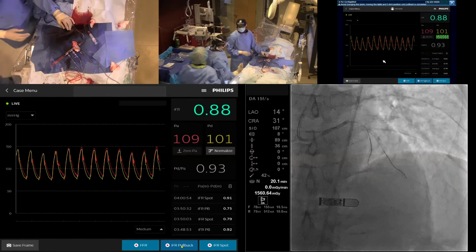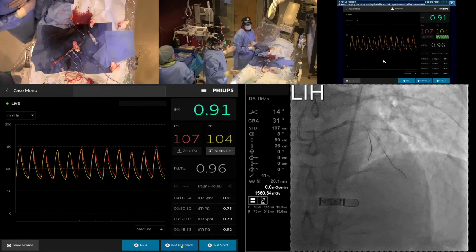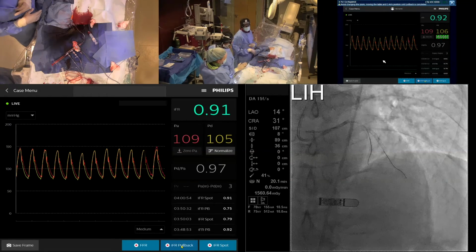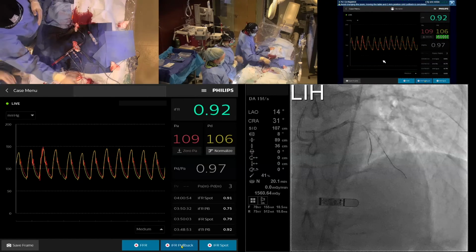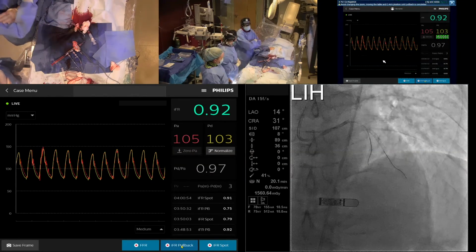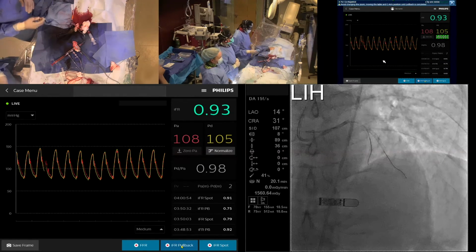Okay, stop. Nobody talks. This is another... Okay, guys, how incredible is this that you could predict the entire procedure ahead of time? You knew exactly how much contribution each of these lesions had, and you could plan the whole procedure before you did anything. Guys, I mean, honestly, how crazy is that? It's actually pretty unbelievable. It's pretty cool. It's very cool.